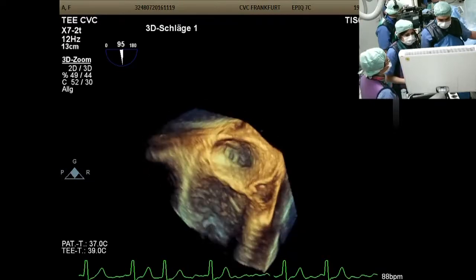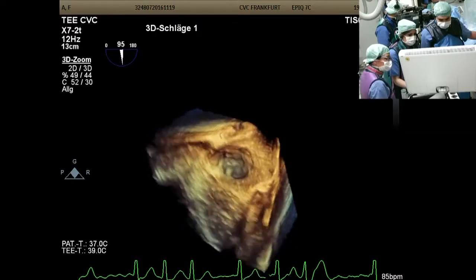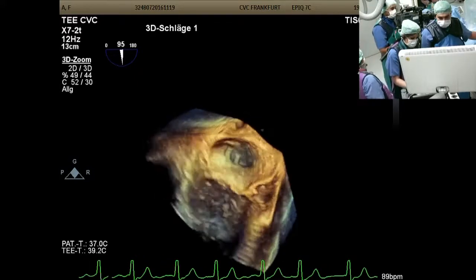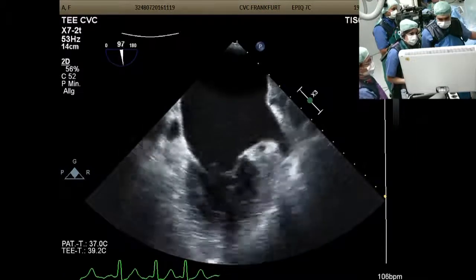I would. The tiny lobes that we're seeing, if that's the right word for them, trabeculations almost, it seems, are potentially nidus for thrombus formation in a low flow state, I would say, given how small they are. We're just going to do our last view at 135.